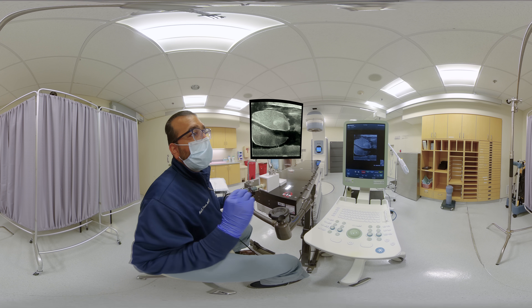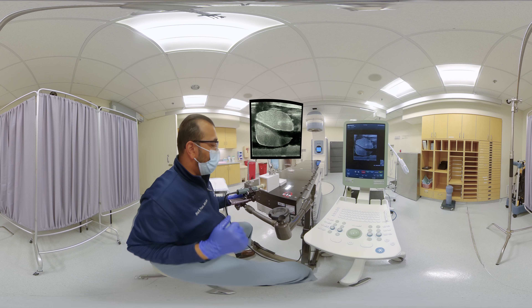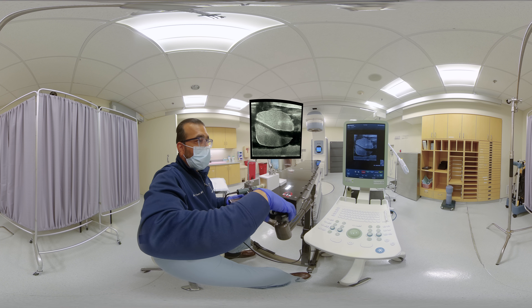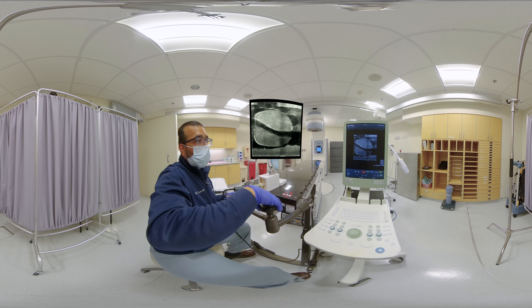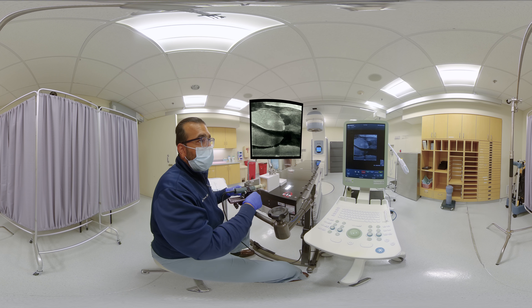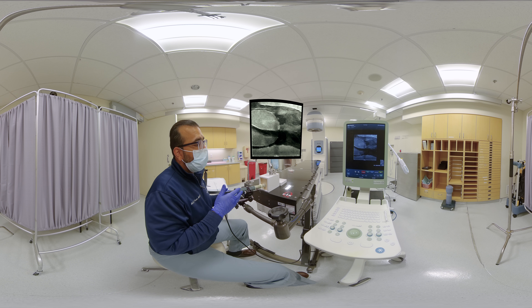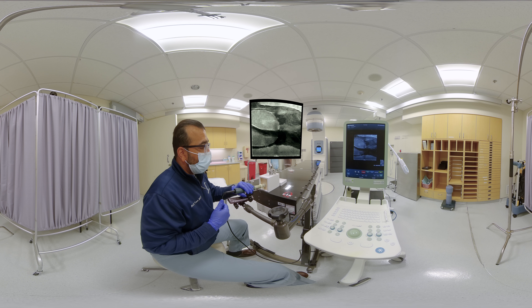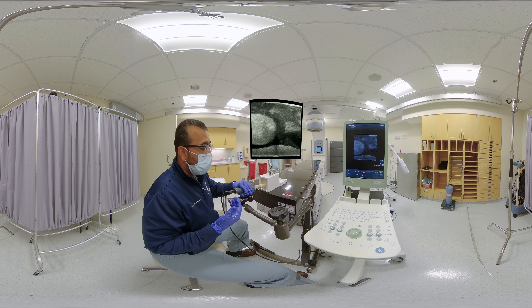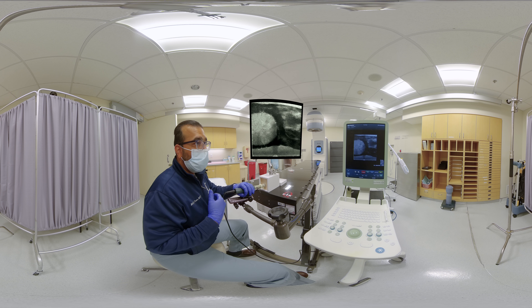We'll review some sagittal anatomy. Here's the apex of the gland, here's the base, and the urethra in the middle. If it was off the midline, you would not be able to visualize the entire urethra, assuming the patient has a typical midline urethra. So we prefer it in the midline for consistency. Other terminology we'd like to use is rotating or rocking the ultrasound, which is rotating the ultrasound to better view a lateral aspect of the gland. In our clinic, we prefer to use the patient as a reference and always specify the patient as the reference point. This is rotating or rocking to the patient's left, which is the provider's right, and then this is rotating or rocking to the patient's right, which is the provider's left. And now we'll go back to midline.